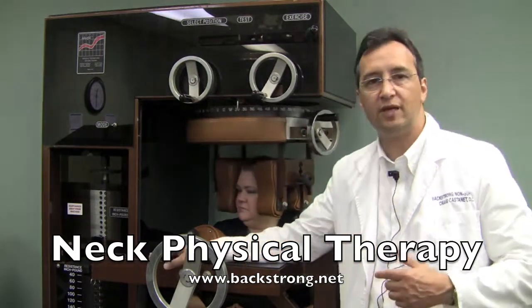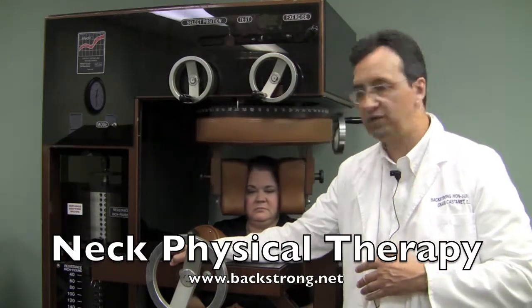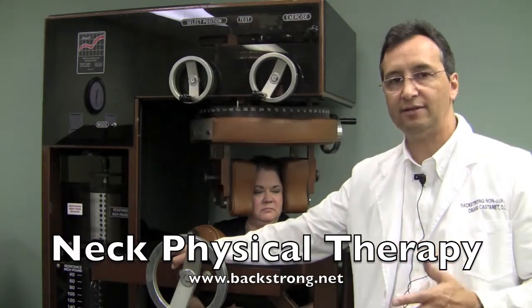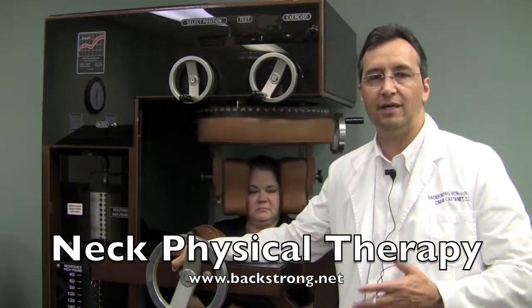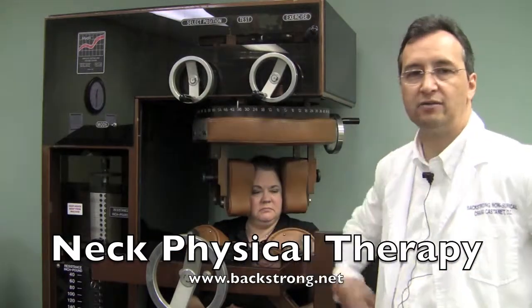And they're encouraged because over time that disparity will diminish and they'll be more equal side to side in terms of the range of motion and the pain. Nothing makes a person happier when they're in pain and they're disabled than regaining that function. It makes you grateful again for the function that we take for granted when we're not in pain and disabled by injury or degenerative changes. So that's the explanation for Med-X cervical rotation.